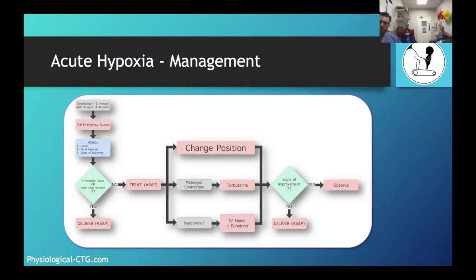If the variability doesn't come back, can this baby recover from this hypoxia? The answer is no. There is no way this baby can recover, simply because the moment the brain is gone.